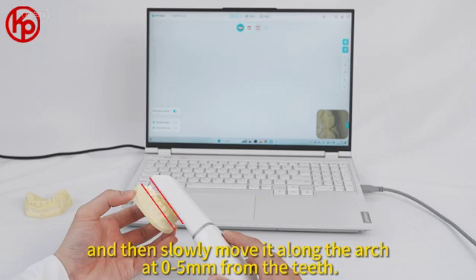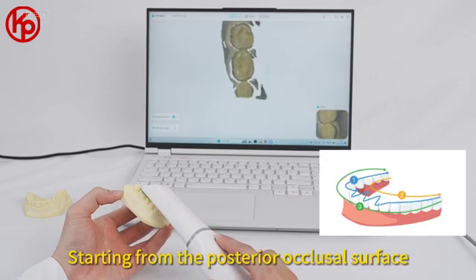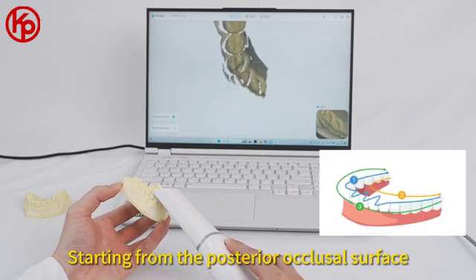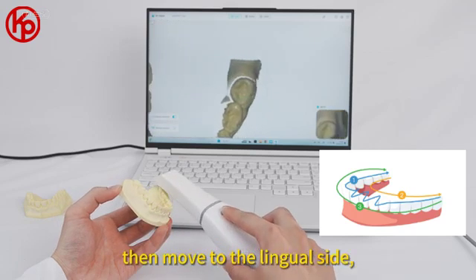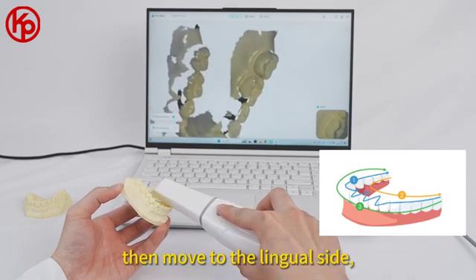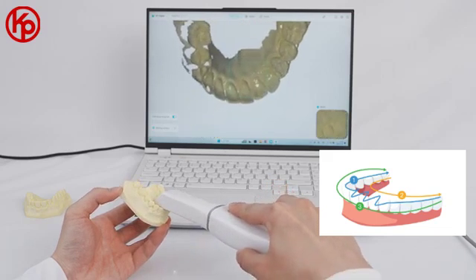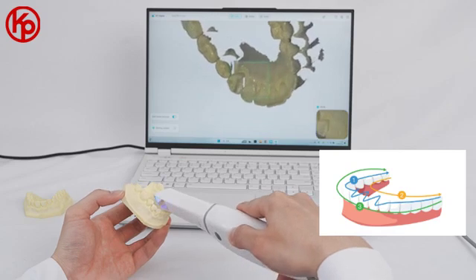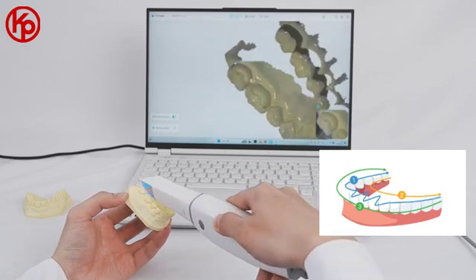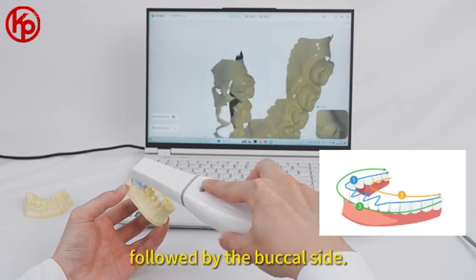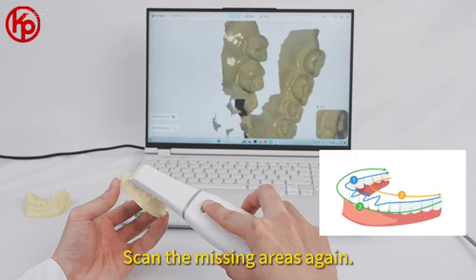Move at 0-5mm from the teeth, starting from the posterior occlusal surface, then move to the lingual side, followed by the buccal side. Scan the missing areas again.